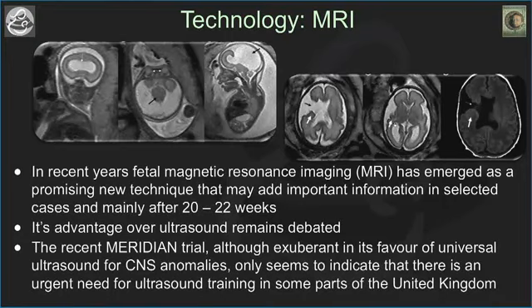Fetal neurosonography also encourages the use of MRI as a problem-solving modality. And the 2 areas where it is particularly useful is if you have a huge amount of fluid in the brain, or for looking at schizencephaly.